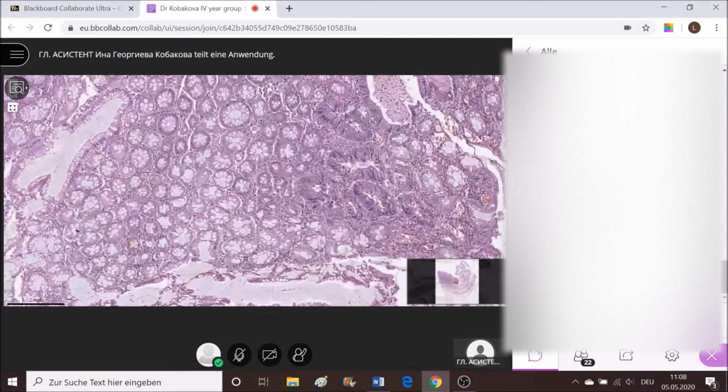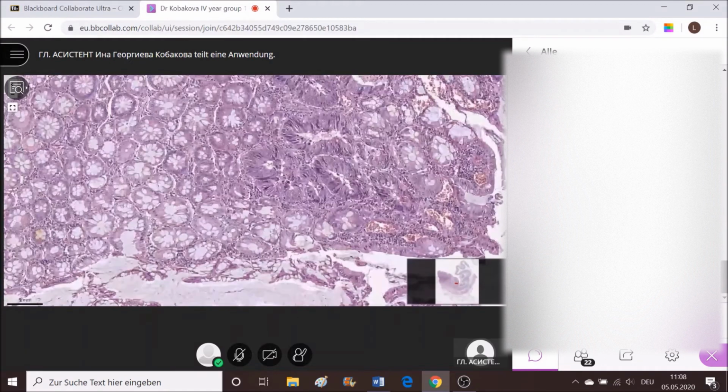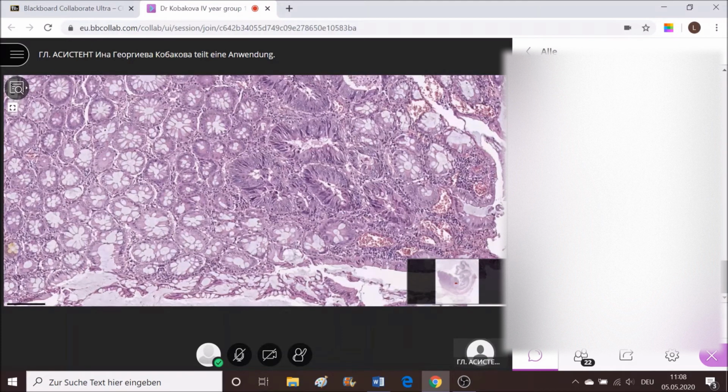If a clinician takes a pinch biopsy from this place here, I would answer high-grade dysplasia. Make a difference between the cells. These have basally positioned nuclei, with a lighter cytoplasm, looking like daisies. That's how colonic glands actually look. Unlike here, where they are on multiple layers, and the polarity of the glands is lost, they also appear with some irregular forms, not yet merging with each other.